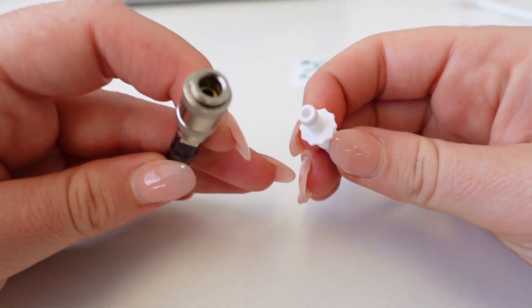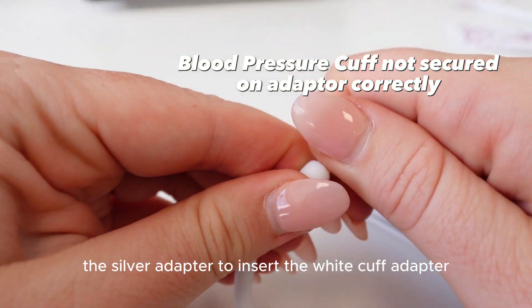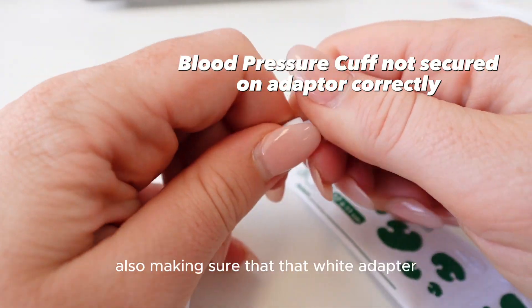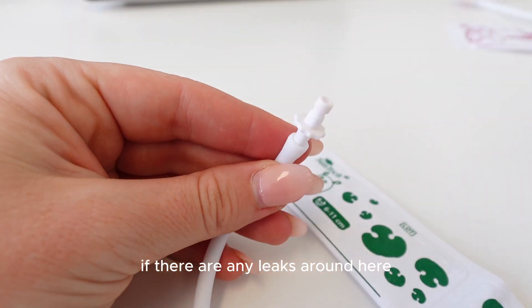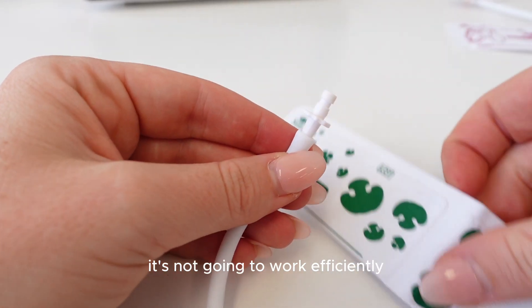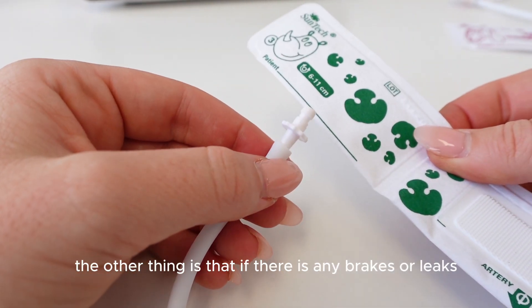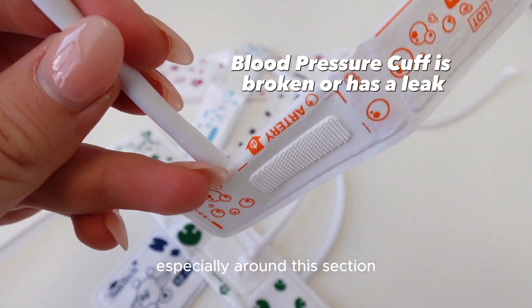Another issue is your cable from your blood pressure monitoring machine not being connected properly to your blood pressure cuff. Always make sure you're sliding back the silver adapter to insert the white cuff adapter, and make sure that white adapter is connected to the white cable properly. If there are any leaks, the cuff won't blow up properly and won't work efficiently. Any breaks, leaks, or damage to the cuff itself especially around that section will not give you an accurate reading.